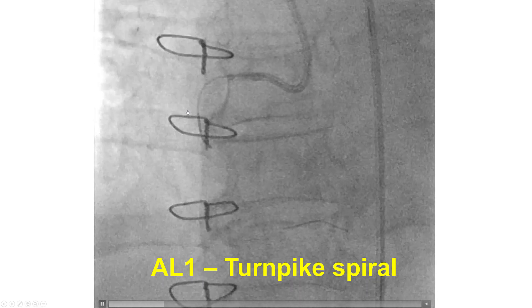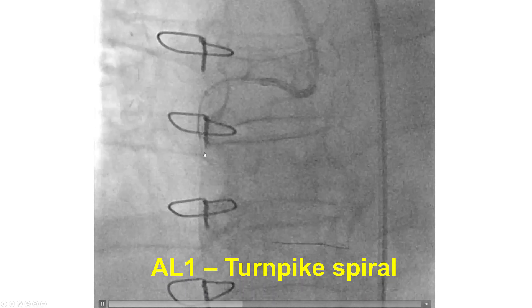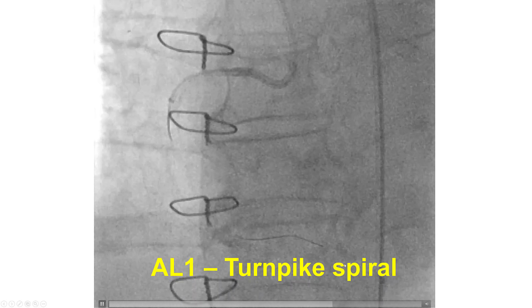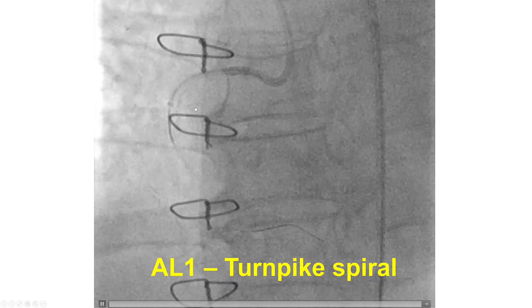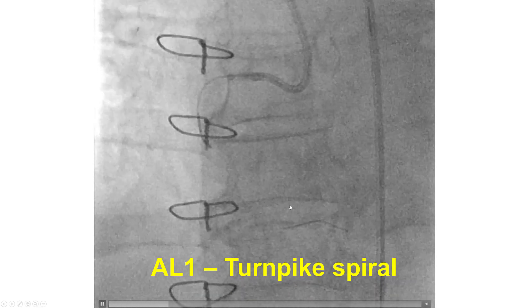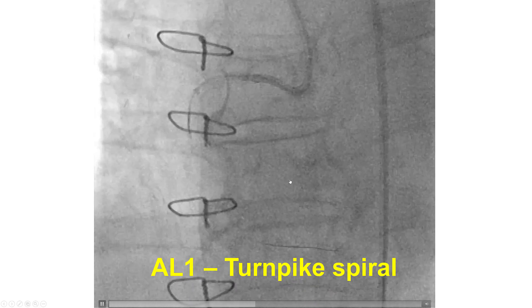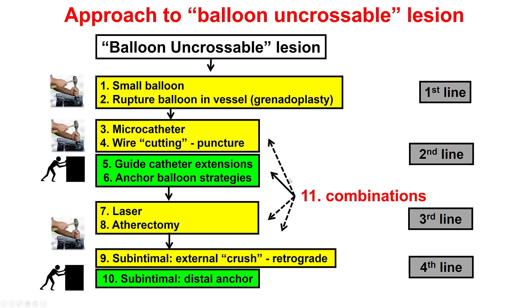We wired the native RCA relatively easily using a Turnpike Spiral microcatheter and a Sion Blue workhorse guidewire. But then no balloon would cross — the Turnpike would not go through either. We were now in an example of a balloon uncrossable lesion.